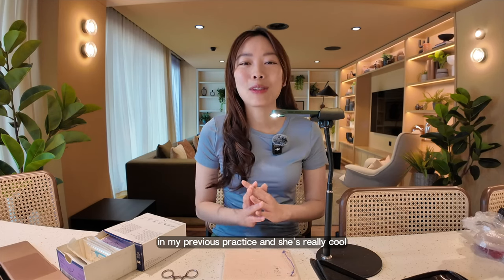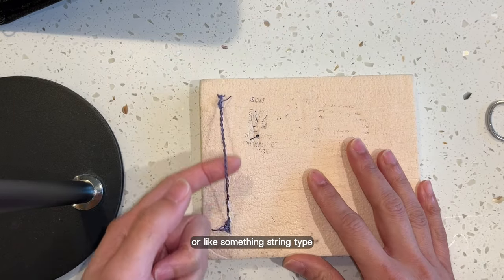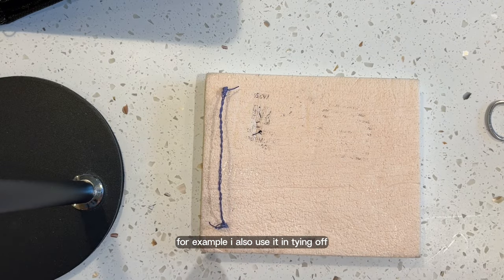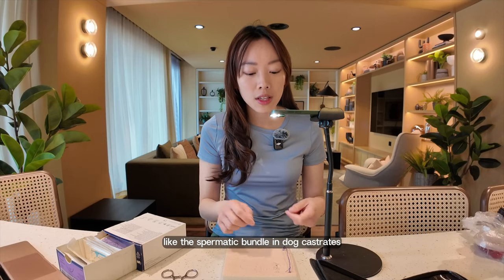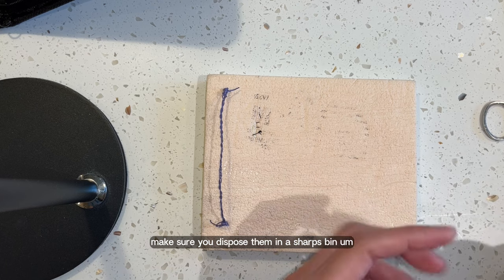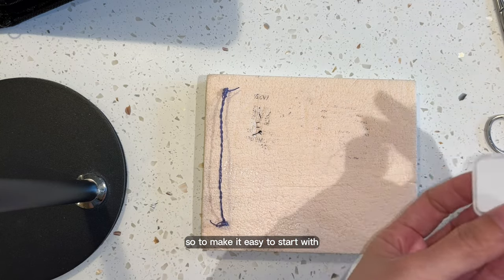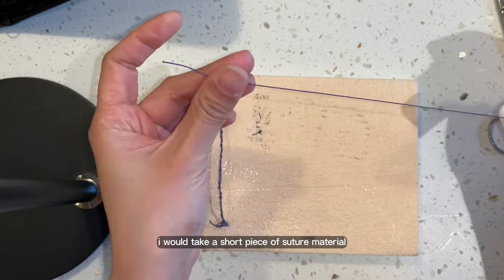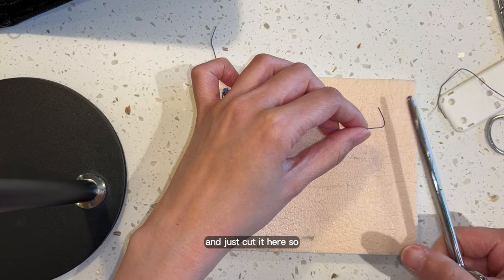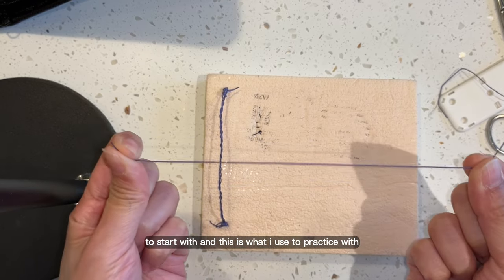I really like the Miller's knot because it has good knot security. This was taught to me by my previous boss. You can even get a shoelace or some string that's a little bit thicker to mimic the suspensory ligament. I also use it for tying off the spermatic bundle in dog castrates — it's just a nice knot to get used to doing. Also, if you have needles at home, make sure you dispose of them in a sharps bin responsibly. So to start, I would take a short piece of suture material like this and just cut it here.